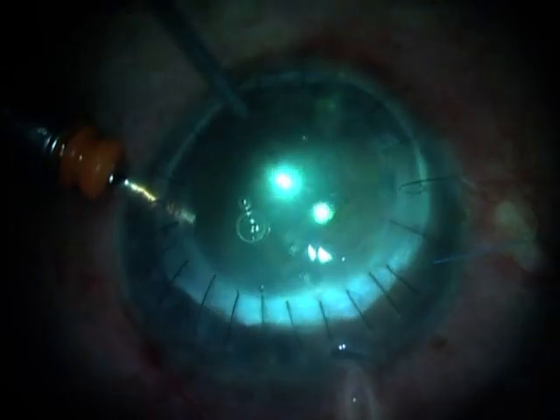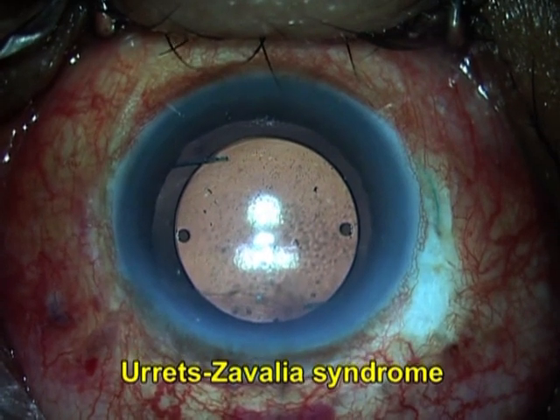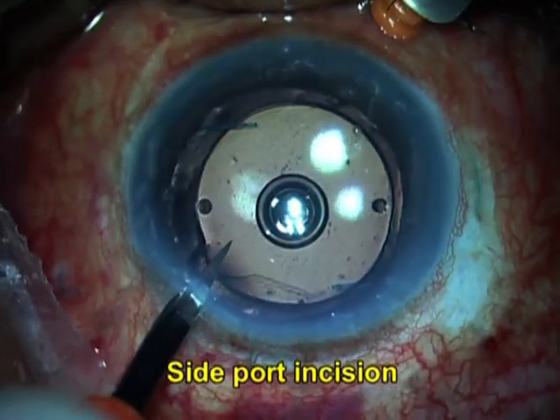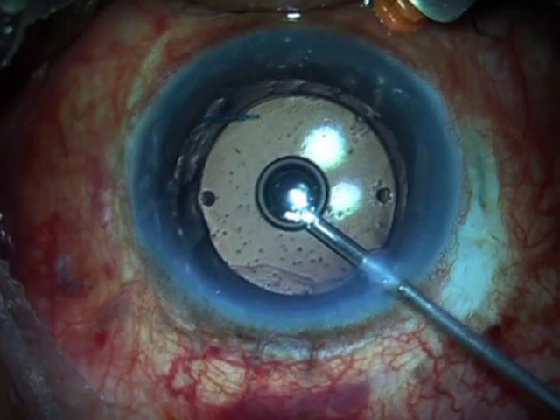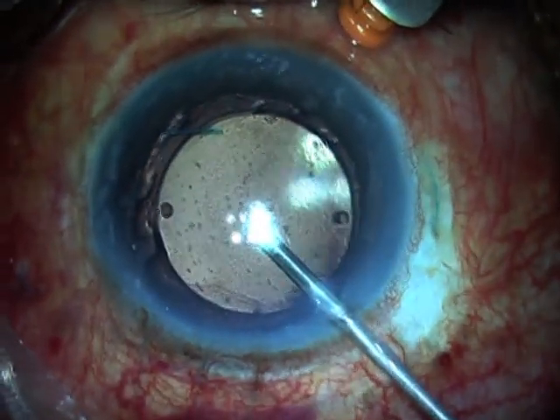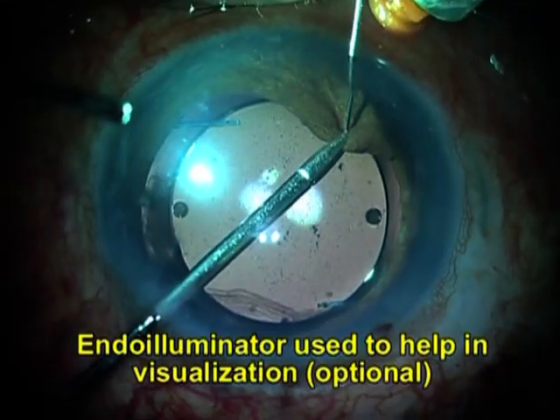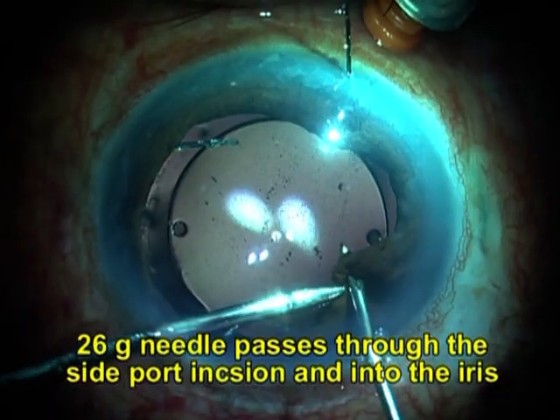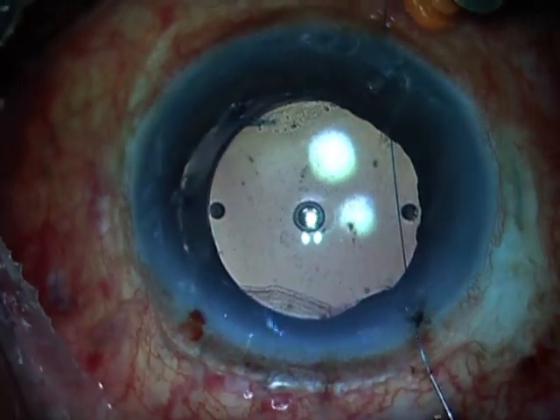The basic principle here is simple. Pre-op and post-op, the angle has to be opened and the intraocular pressure reduced. Urrets Zavalia syndrome can occur even after a glued IOL. If the patient has only mydriasis, without a closed-angle glaucoma, photophobia and glare are the main symptoms. These patients benefit from pupilloplasty. An endo-illuminator from outside can help in visualization.